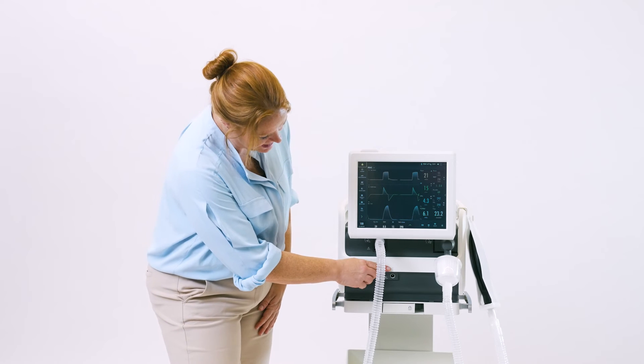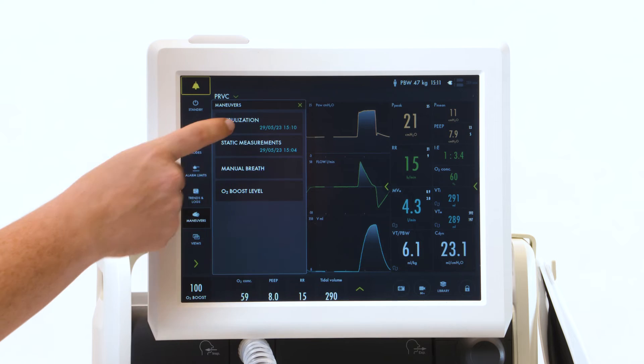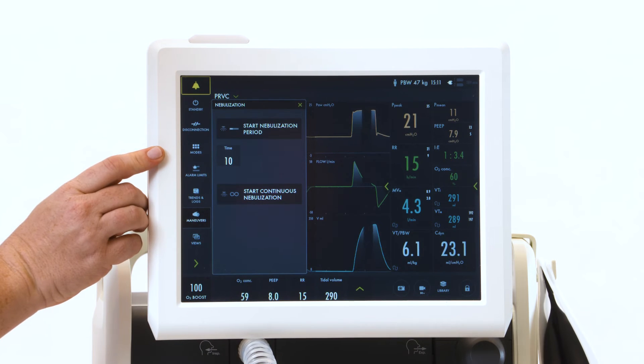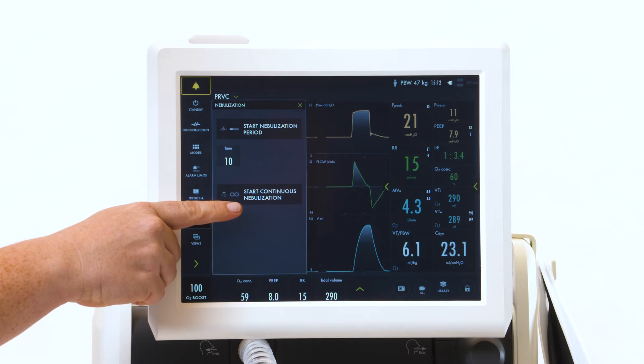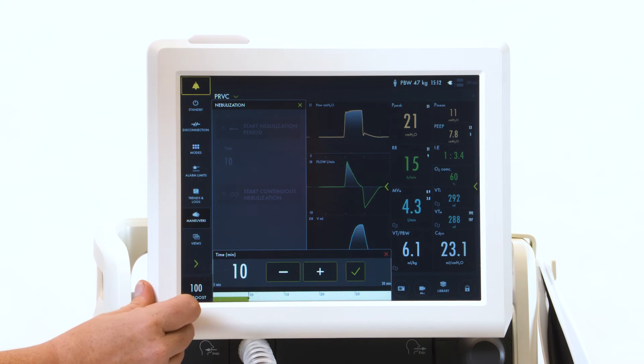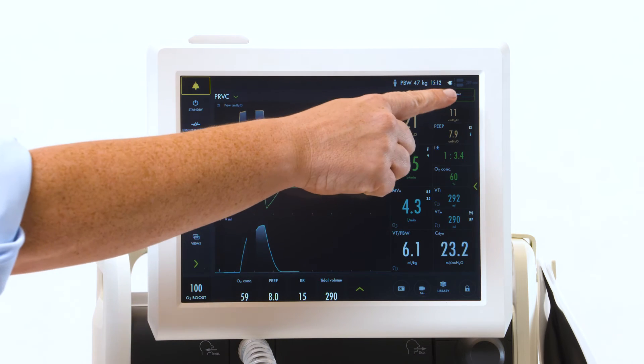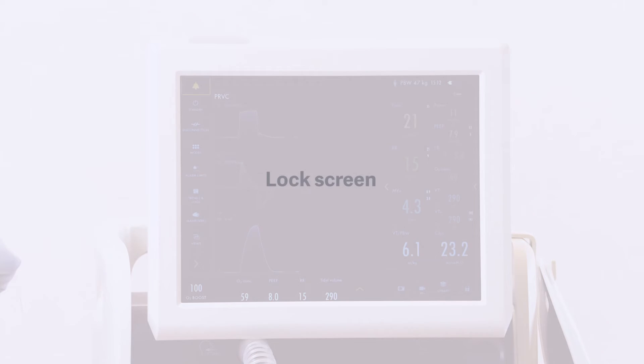Aerogen Technology is built into every single ventilator and is connected at the bottom. Select the maneuvers tab and go to nebulization. You can run it continuously or intermittently, choosing between 5 and 30 minutes. Check mark and hit accept and you'll see the nebulization appear.